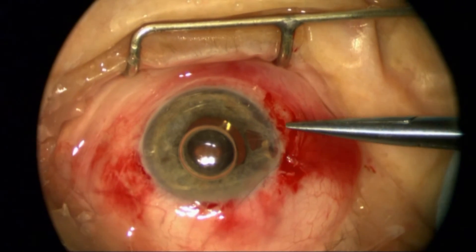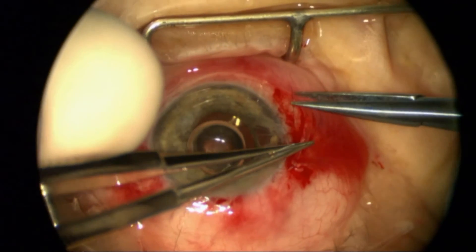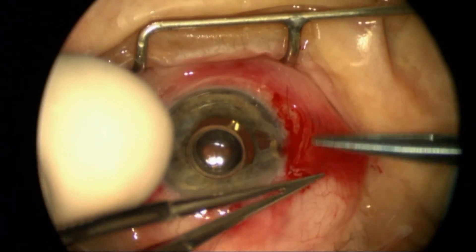I'm going to rotate the knot into the sclera here, and then just close off that area with the conjunctiva with some suture, with the knot buried underneath the conjunctiva.